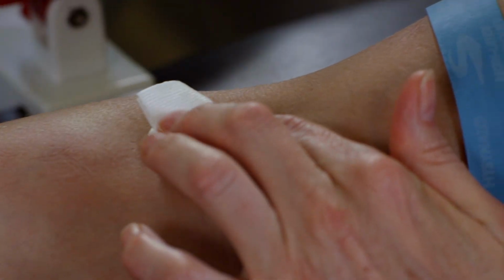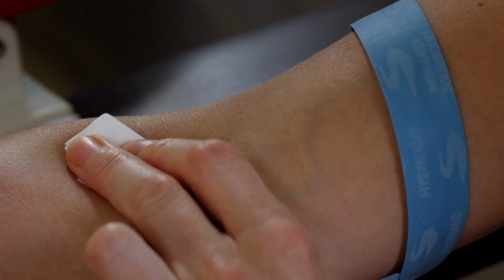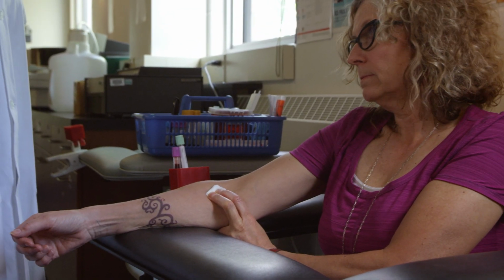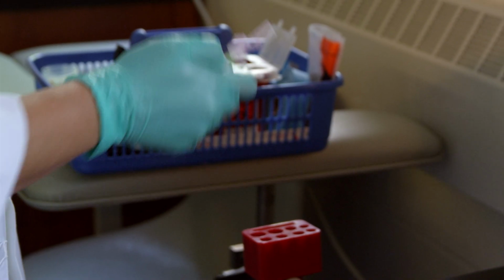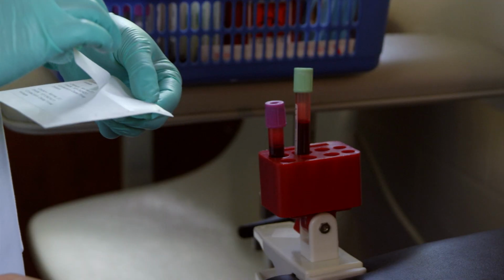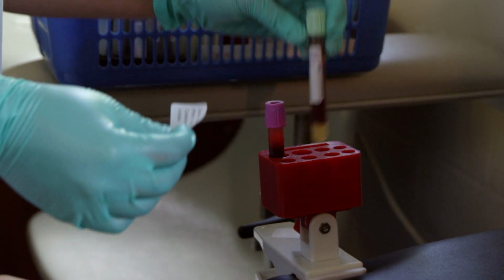When the blood collection is complete, the needle will be removed from the arm and pressure will be applied on the site with a gauze pad. You may be asked to apply this pressure with your alternate hand. The phlebotomist will activate the safety device on the needle and dispose of materials used. Tubes will be immediately labeled in clear view of the patient.